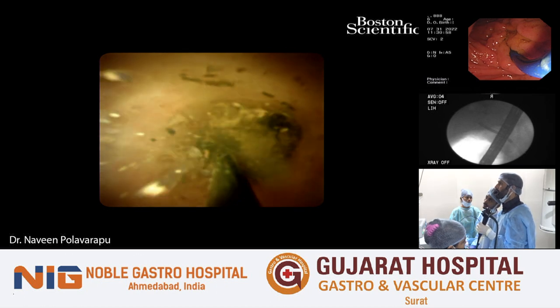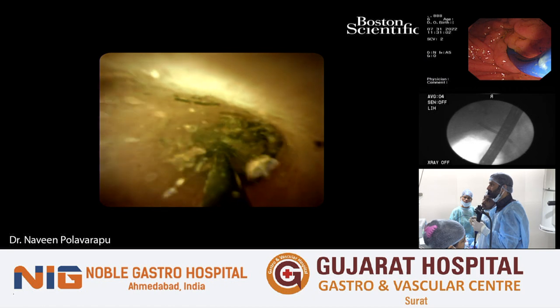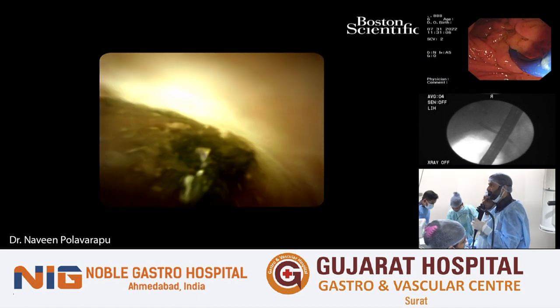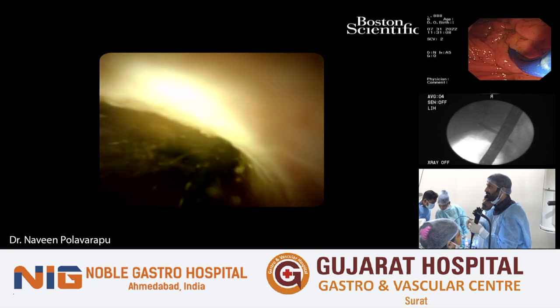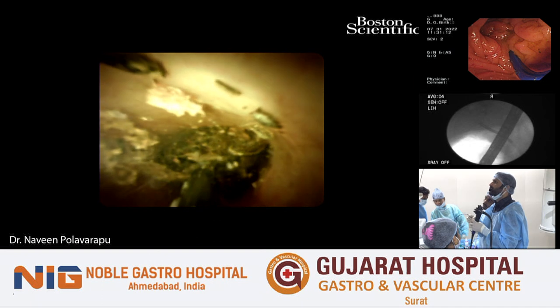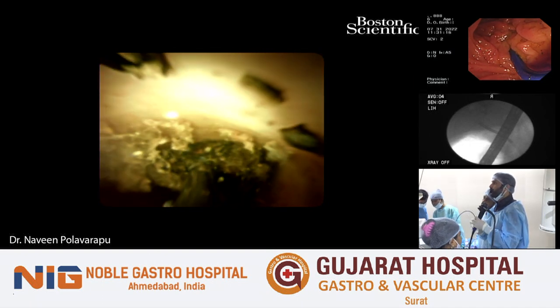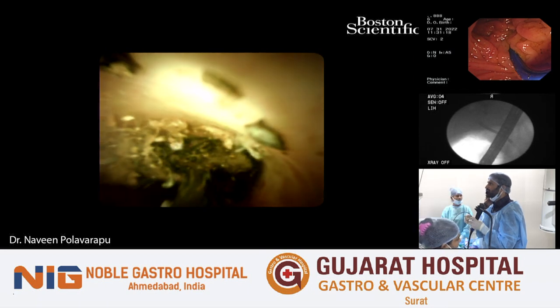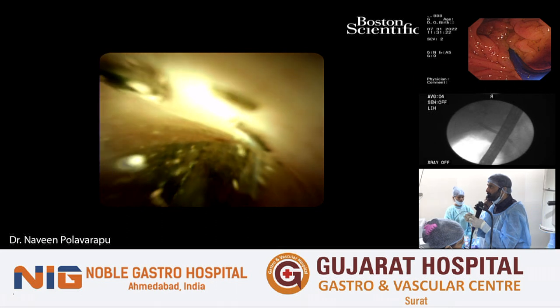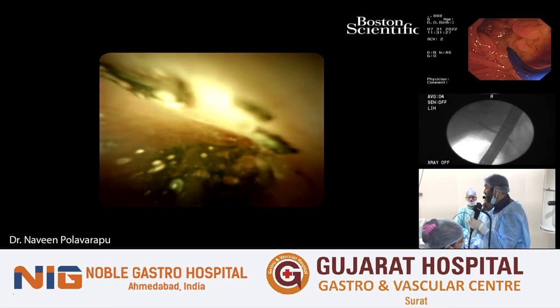Dr. Naveen, is this another stone? Yeah, there's another stone which I'm breaking. Okay, this is the one impacted which was the culprit. Yeah, probably. You're right. Because as I'm coming down, I can see more stones like this. So that's why I'm trying to break this stone as well. This seems to be a slightly harder stone. Can you go up to 5, please, in the pulses?